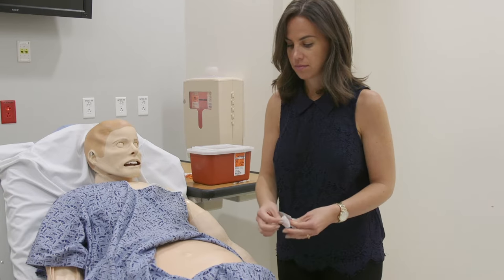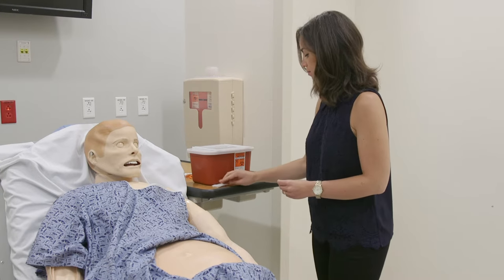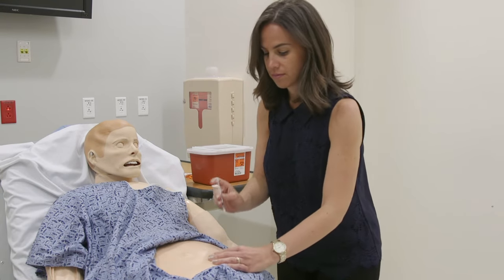Wipe your skin with an alcohol pad. Dry off any excess alcohol on your skin before injecting. Do not inject through clothing. Pinch a fold of your skin between your thumb and finger.